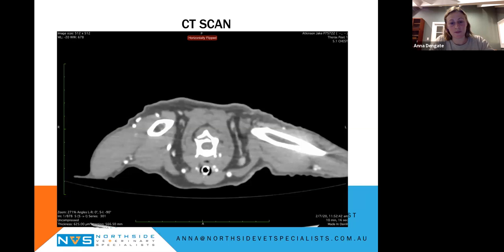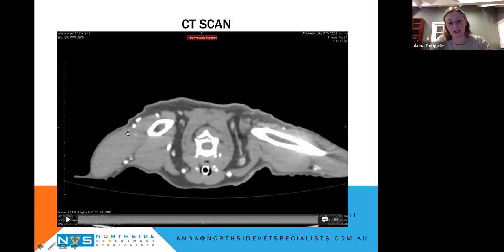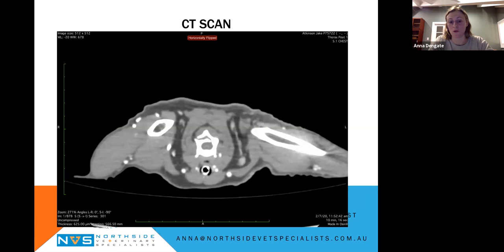That's pretty disappointing given the pulmonary artery on the radiograph, isn't it? I know, absolutely, yeah. But I actually looked specifically for a tricuspid regurgitation, couldn't find one, and the right ventricular wall looked normal. There was no significant flattening of the septum, to my knowledge. So I couldn't find any evidence of pulmonary hypertension on the right-hand side of the heart in this cat.